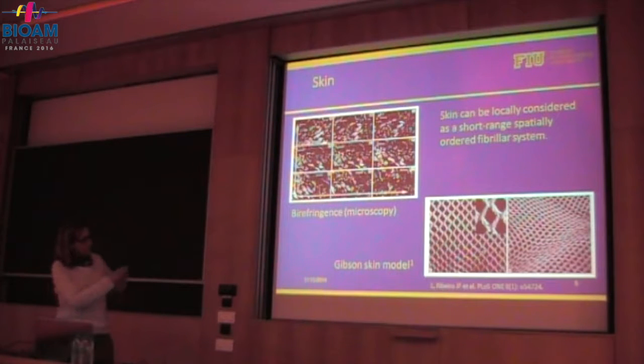And this is actually skin that is being pulled in this direction and in this direction. And skin ultimately really behaves like a mesh, so that you can see these patterns, the anisotropy of collagen, changing just by stress.